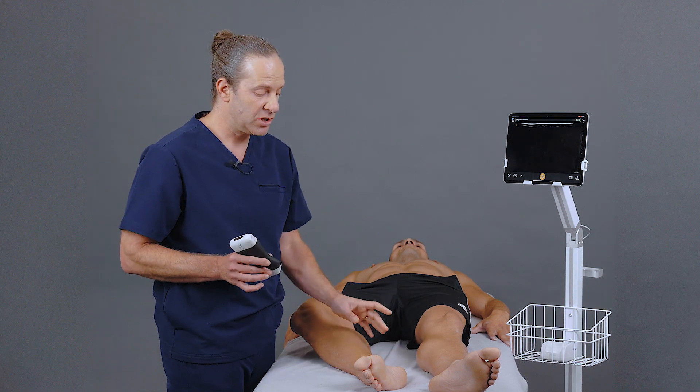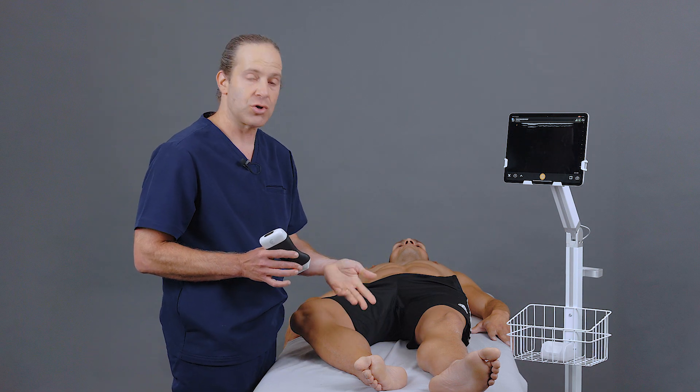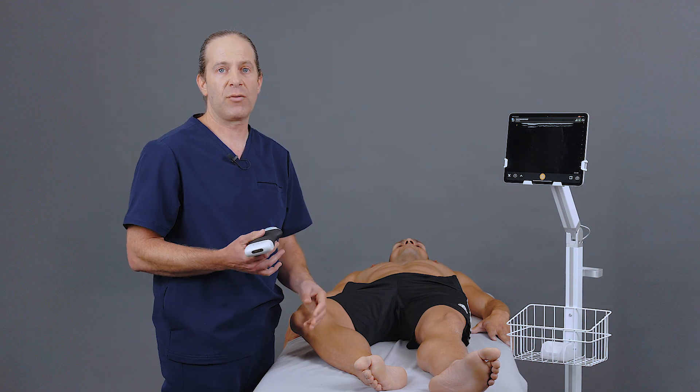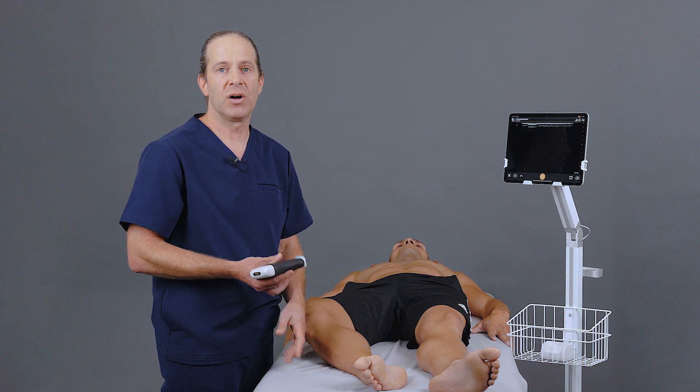Once the block is inserted, the patient will soon start to get anesthesia to the sole of the foot, really allowing me to control their pain or to facilitate whatever other procedure it is, like a foreign body or laceration repair that I need to do on the sole of the foot.